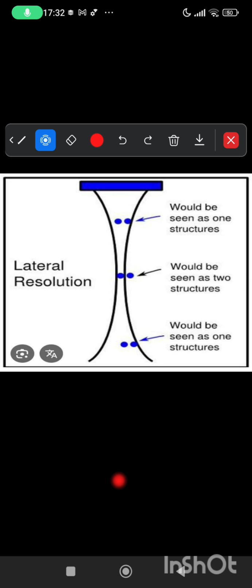Excellent. Because in the near field and far field the beam is too wide. Think of two candles placed side by side, and the whole beam covers them, includes them. So both reflectors are hit at once. We see one candle, not two. Because these two objects are located within the beam width, they are taken as one structure.